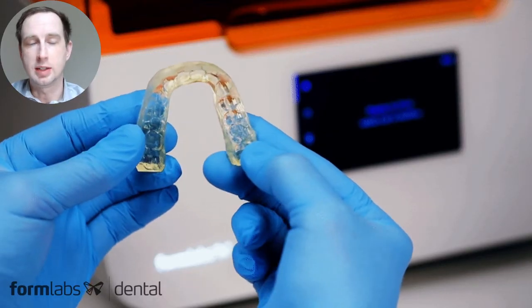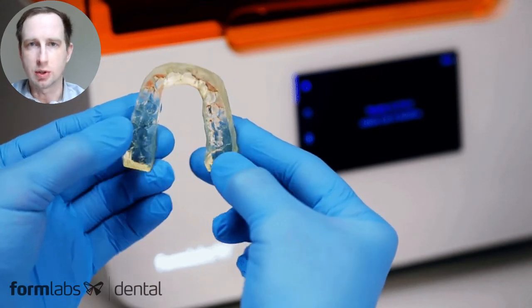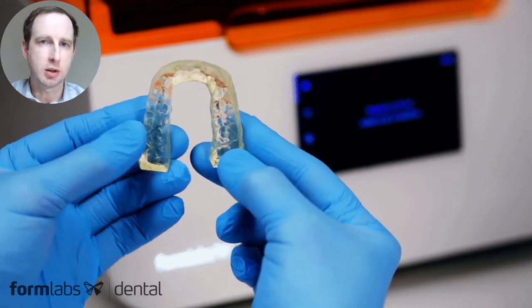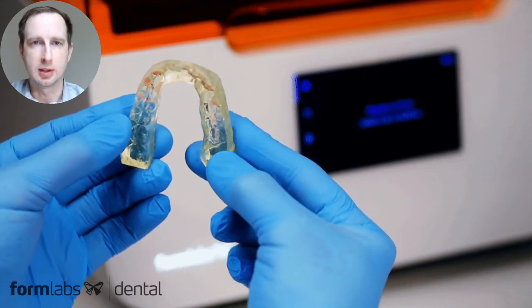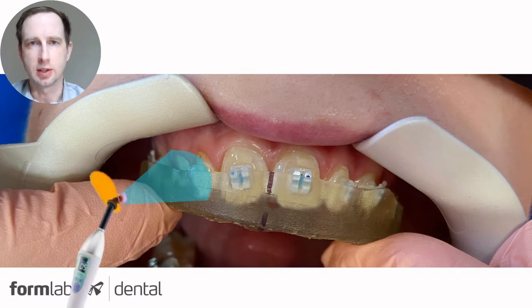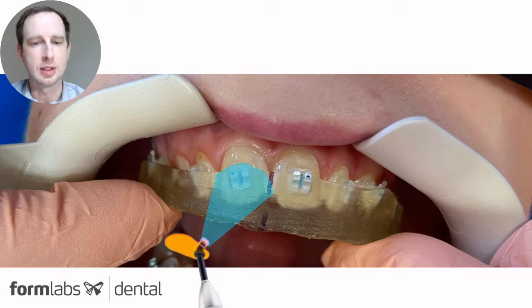The flexibility and tearability of this product has been optimized so the appliances are easy to insert but also remove, even on full coverage brackets, with an optimized tear strength that you can actually tear away the appliance once it's complete and bonded in place. We also made sure that during testing the reliability and accuracy met our standards, as well as did validation testing on the UV transmission rates of the material itself. The translucency and color of the material allows for the contrast of the brackets to be easily seen through the device and ensure proper fitment.